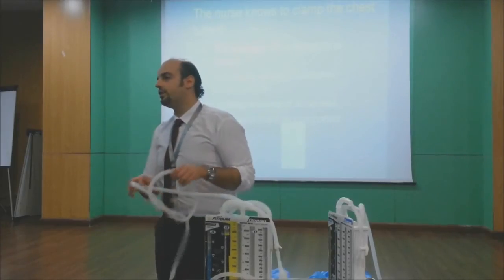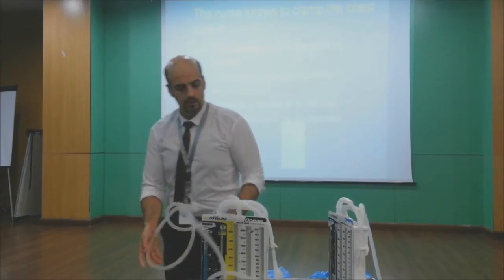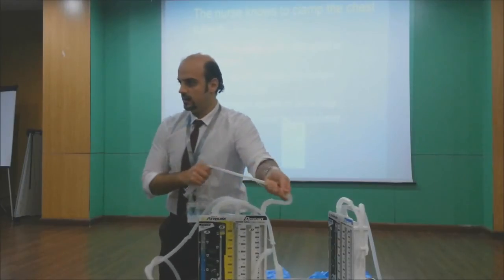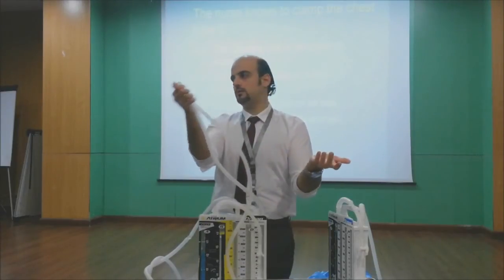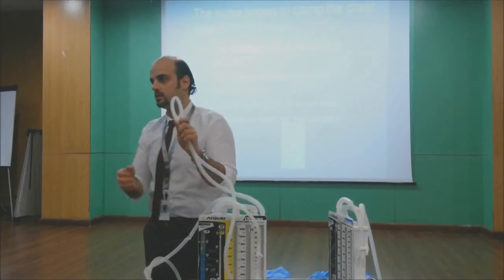Okay, don't do this. There are two ways of milking. To get an artery or a clamp and do this milking. And there is another way of milking, this way. This way is easy. It's by your hand, not by an artery. So it will not crush.